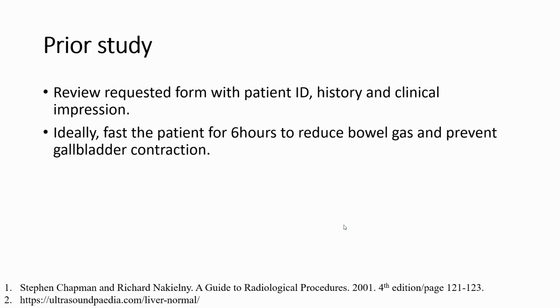So prior to the study, as the radiologist or sonographer, we have to review the request form, focusing on the patient ID, history, and clinical impression written by the clinician. And the patient ideally has to fast around 6 hours before the scan, in order to reduce bowel gas and prevent gallbladder contraction.